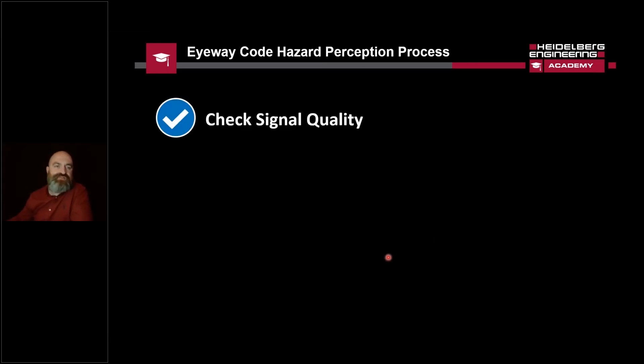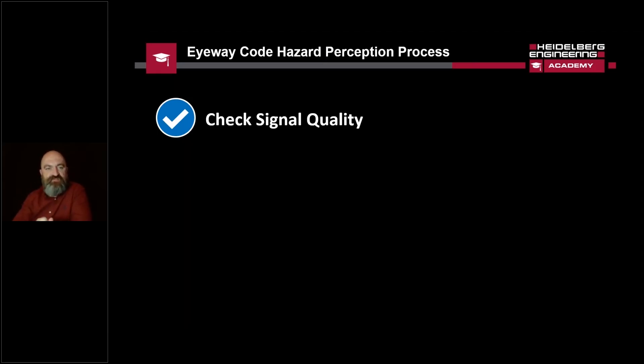Before we could do that, we need a process in place before we start to look for hazards. One of the crucial parts of that process is always checking the signal quality. Checking the signal quality should always be where you begin with OCT, because you don't want to make any wrong assumptions about hazards that are actually only down to artifacts. Checking the signal quality is crucial — look at all those different layers of the retina when reviewing OCTs and make sure you can see them all before making any decisions.